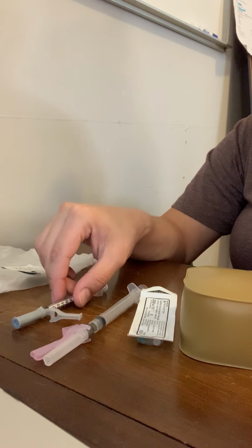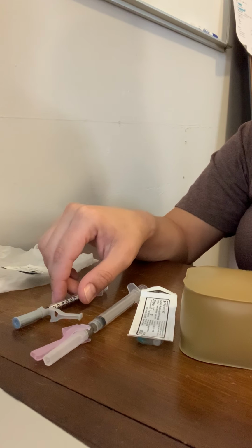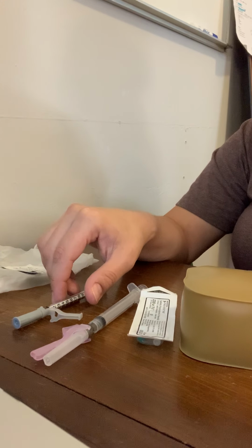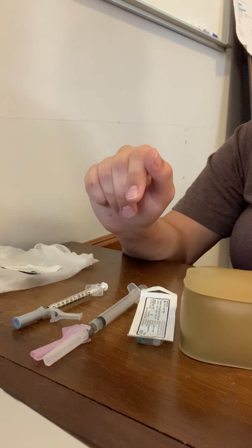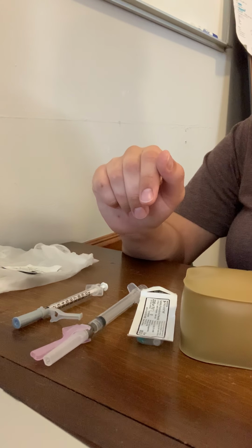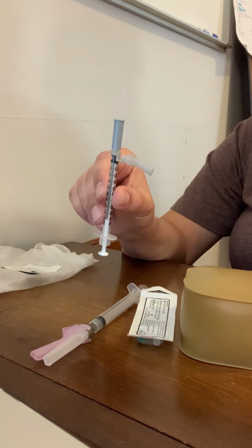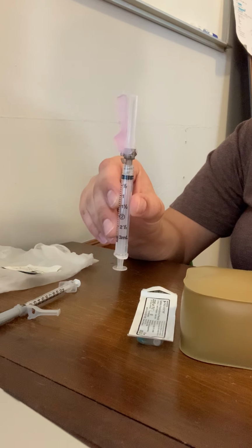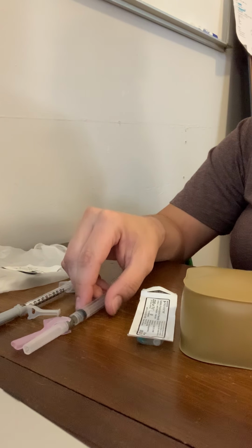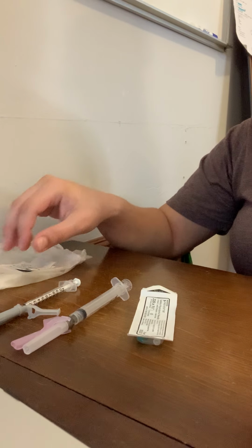And the order was for 25 milligrams of Phenergan, and the vial available is 25 milligrams per 1 ml. So I will just be giving 1 ml of Phenergan. I am using a 1/2 inch needle for my heparin and a 1.5 inch needle for my Phenergan. All right, so I'm going to prepare both of my medications.